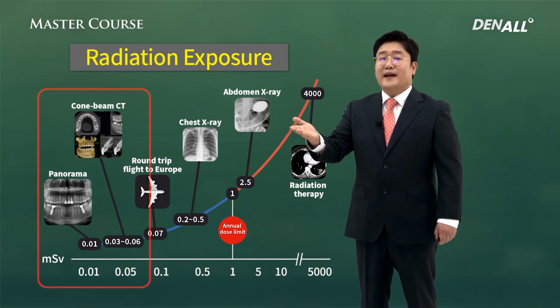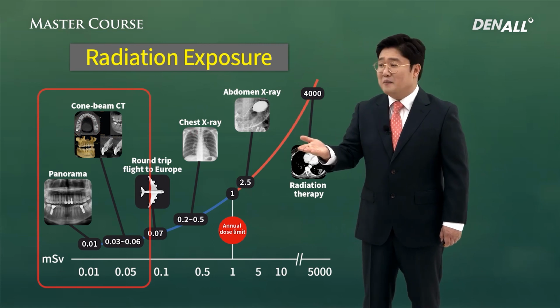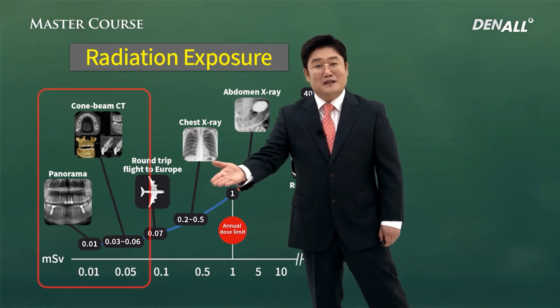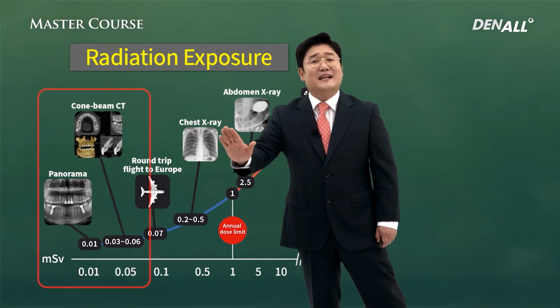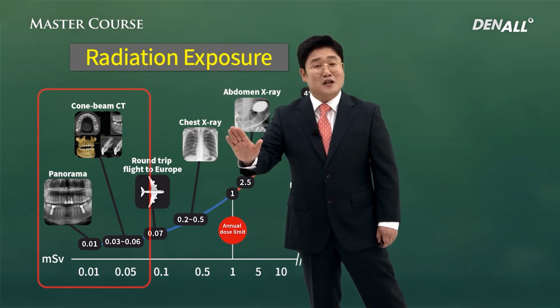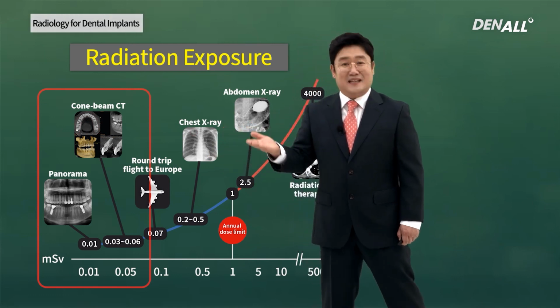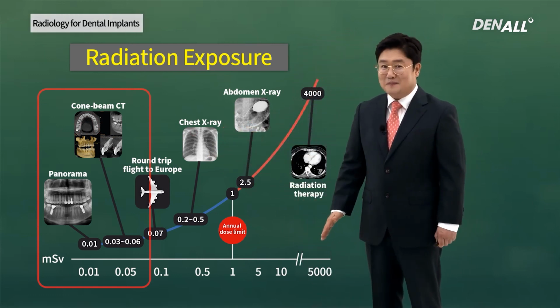When you explain this to your patients, maybe you can say this: a round trip flight to Europe has more radiation exposure than dental X-rays. That means dental X-rays are very safe procedures.